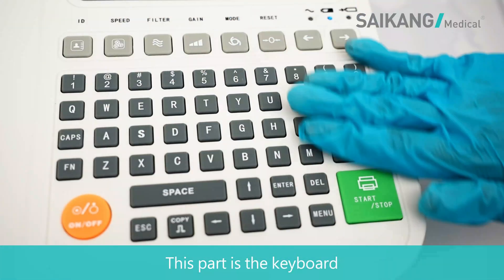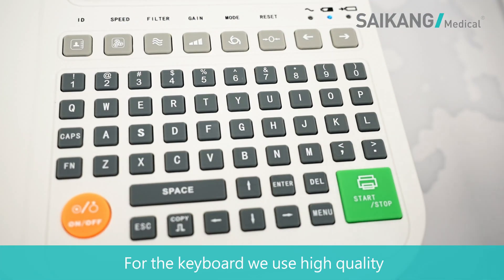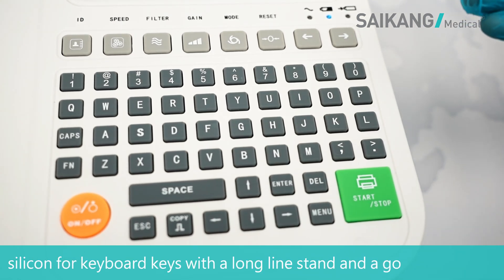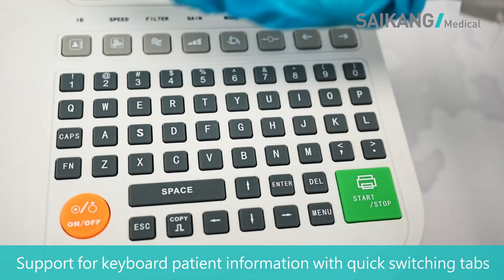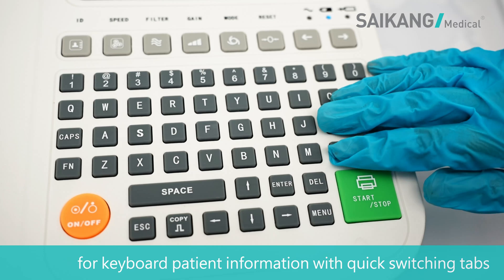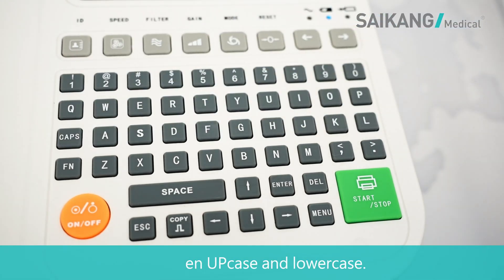This part is the keyboard. We use high-quality silicone keyboard keys with a long lifespan and a good tactile feel. It supports input of patient information with quick switching between uppercase and lowercase.